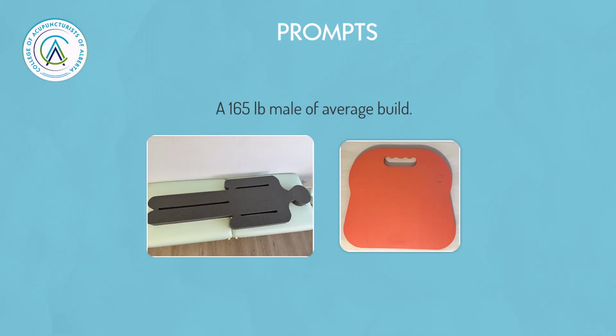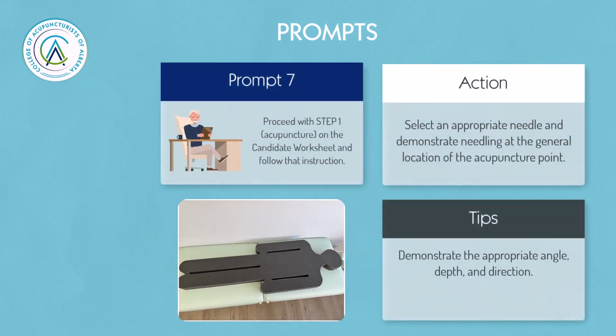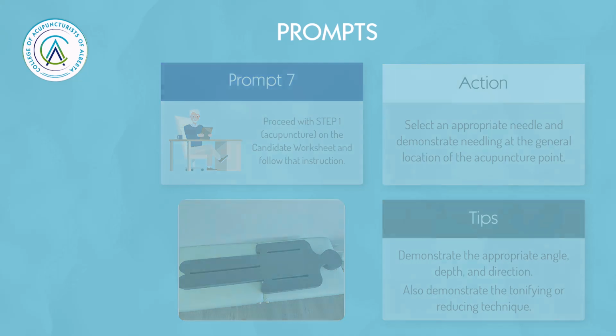A candidate may demonstrate the needling technique on the mannequin itself or move the high-density pad to the needling area and demonstrate needling on it. Tips: demonstrate the appropriate angle, depth, and direction for the indicated acupuncture point. Also demonstrate the tonifying or reducing technique.